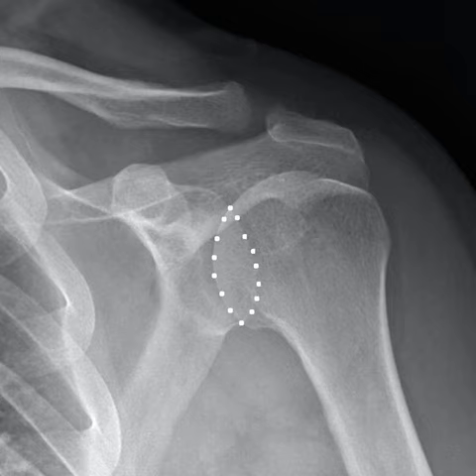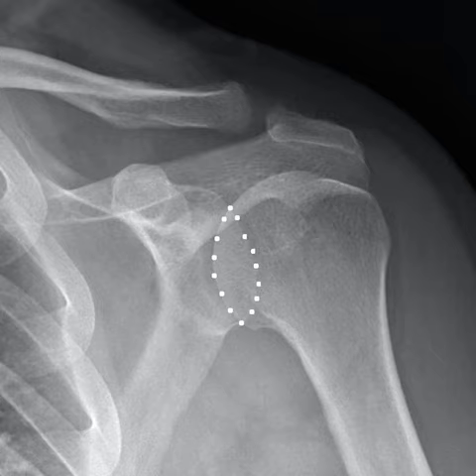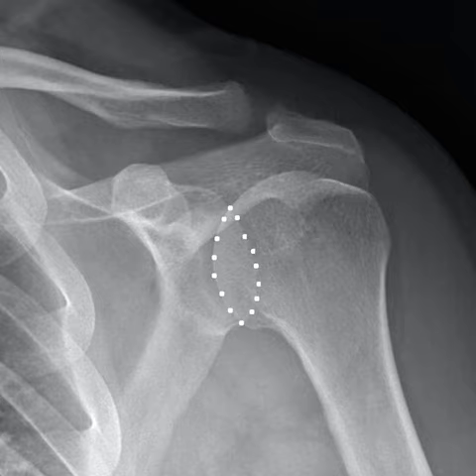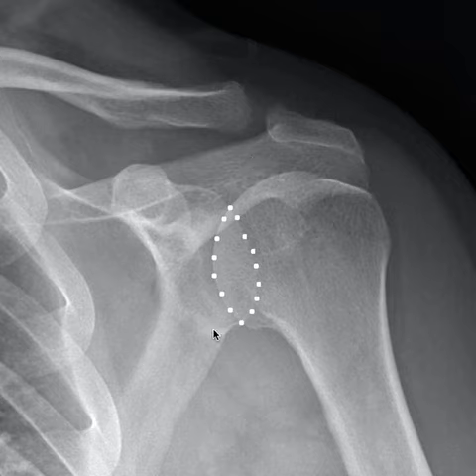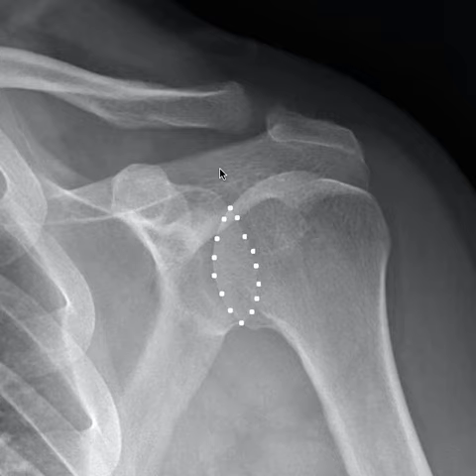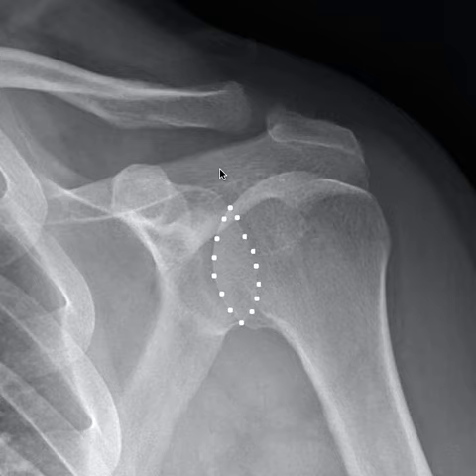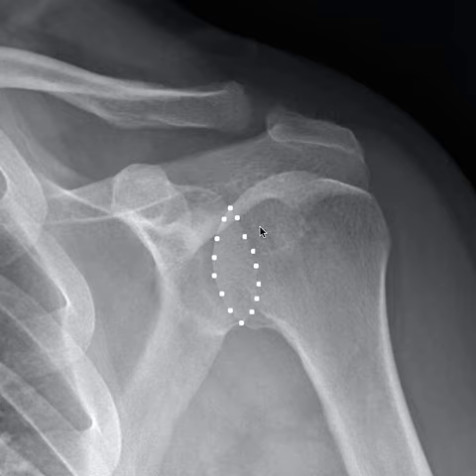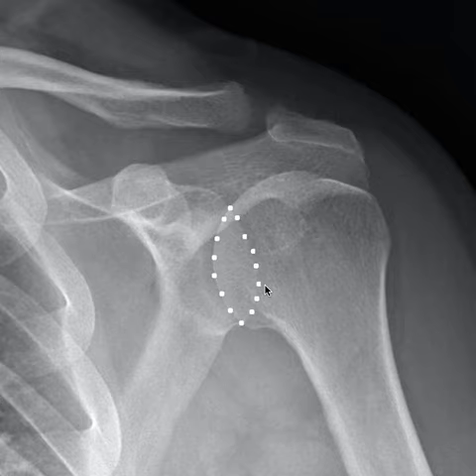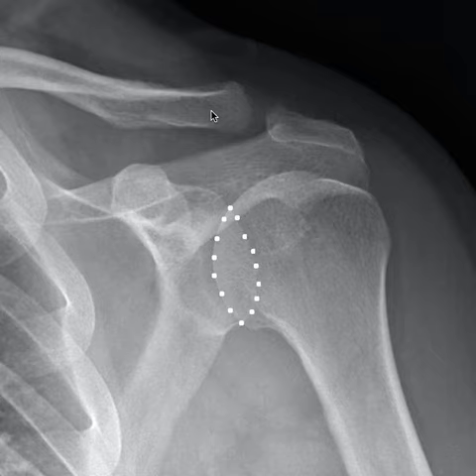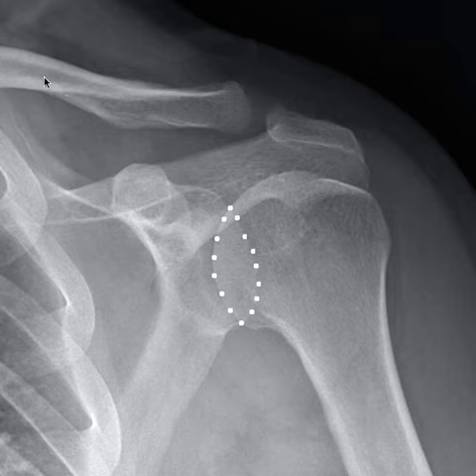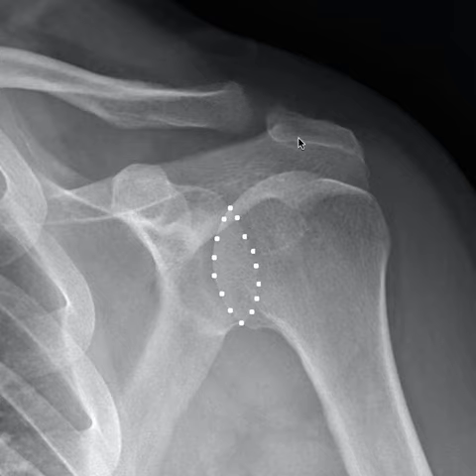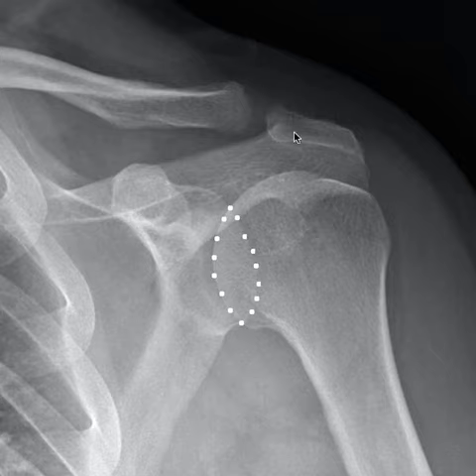The basics of reading a shoulder x-ray: you need to know there are a couple of different views that we look for as orthopedic surgeons. This is your standard AP view of the shoulder. There are a couple of things to notice. You will see some overlap — this is a picture I took off the Internet, all publicly available. This nicely shows the overlap between the humeral head and the glenoid — that's the glenohumeral joint, the shoulder joint. You want to look at the clavicle. It has a curved S-shape, which is why it doesn't look flat or straight. This line here is normal — this is not a fracture. This is the acromioclavicular joint, the AC joint.